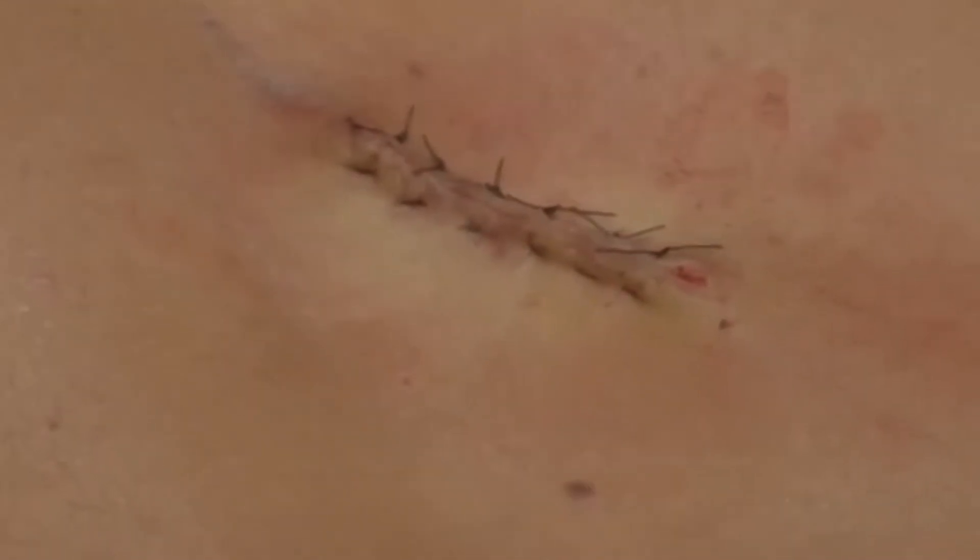A final inspection of the surgical site shows the efficacy of the ARIN 940 high-frequency desiccator by Bovee. The wound is completely sutured, and no bleeding is present.